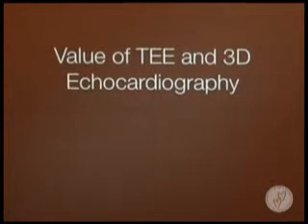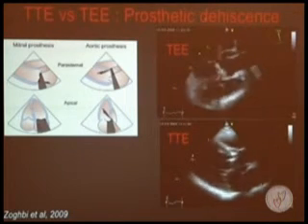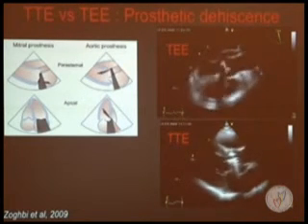How is the value of TEE and 3D echo? Again, this is an image of a prosthetic dehiscence. Compare TEE and TTE. These are the images from TTE.